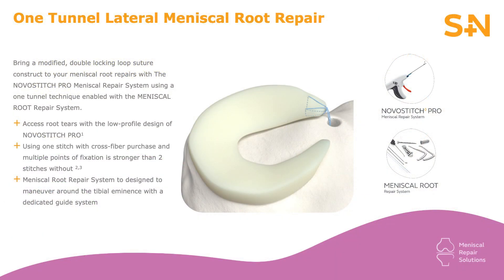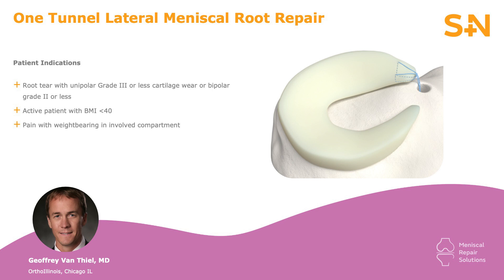The following video shows a technique for a posterior root repair using a NovoStitch Pro device. Not only is this a fun technique once you have all of the instrumentation available and ready, but it also provides significantly improved results when compared to just a meniscectomy of a posterior root. There's good research that shows a high progression to total knee replacement and to advanced arthritic changes in the setting of non-repaired roots. This technique will allow you to both repair the root and improve functional results in the patient following the surgical procedure.